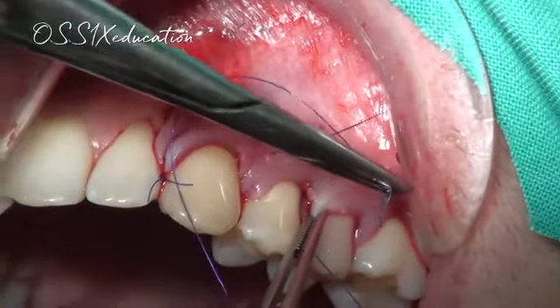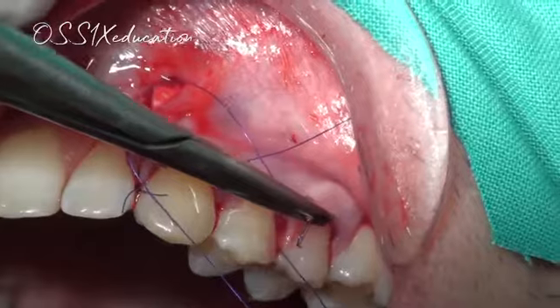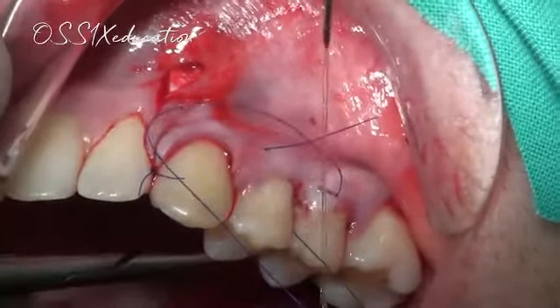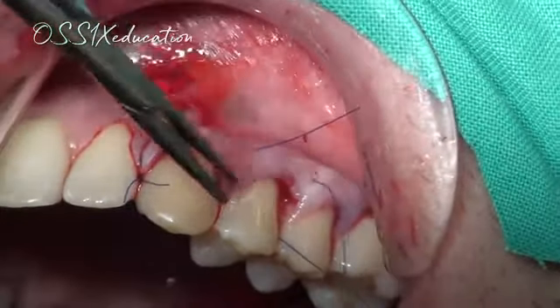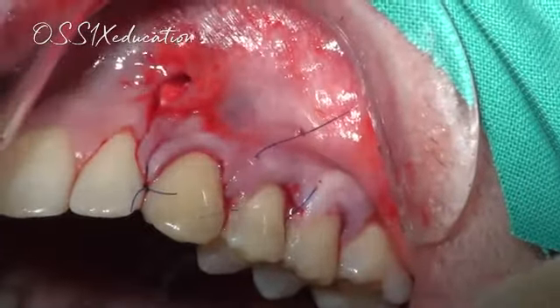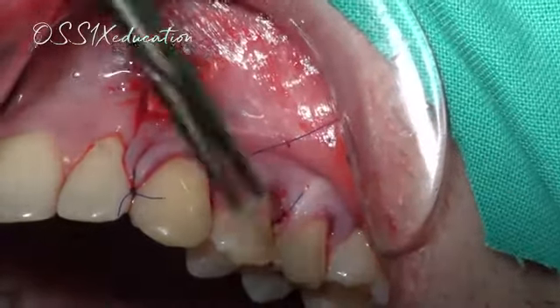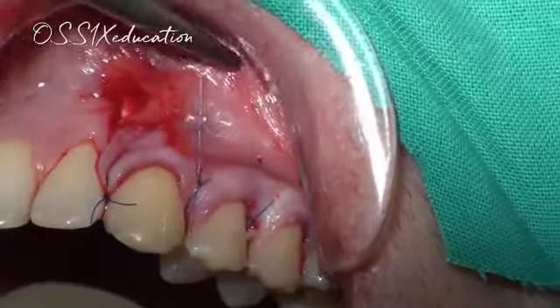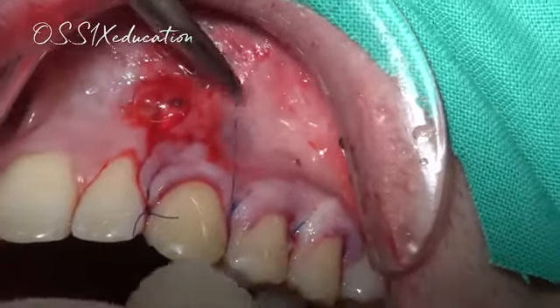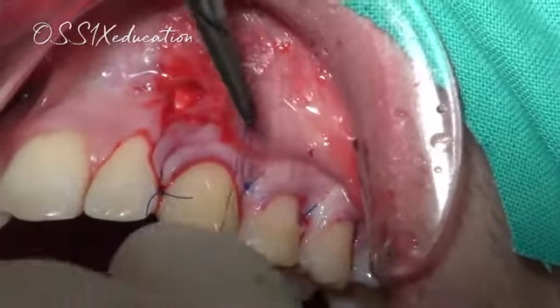You want your needle to pass through the papilla on the palatal side. You go from the palatal side back to the buccal. You want your needle to be a few millimeters away from the tip of the surgical papilla. In the middle, you go through the papilla, through the papilla on the palatal side. You go back here. Now we're going to tie a knot here. And we see how we've been able to move the flap in a coronal position.